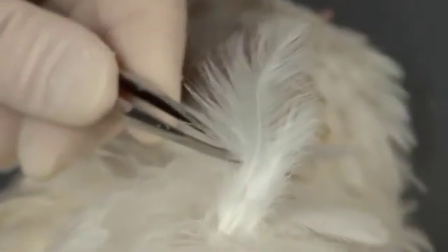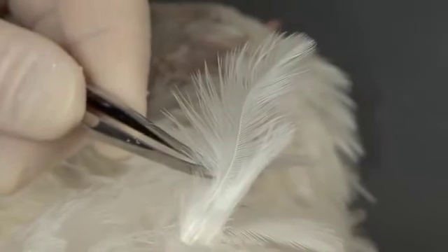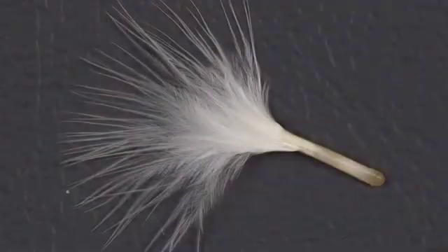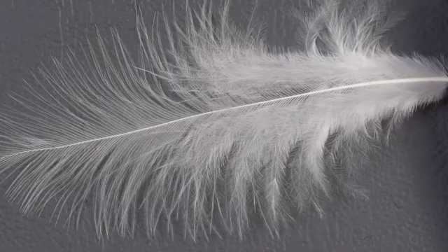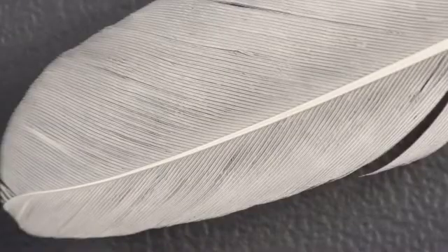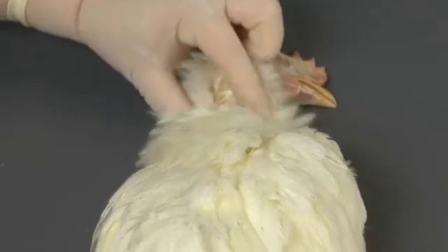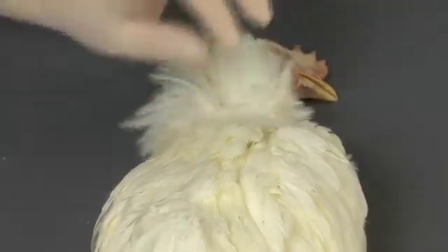Examine the feathers. Birds have several types of feathers distributed across various regions of their body, including down, body feathers, and flight feathers. Look for abnormalities in feather conformation, such as warping or malformed barbs and barbules. Pay attention to the area where the feather emerges from the follicle. Swelling in this location can be indicative of several types of infection. Make note of any body regions that are missing feathers.